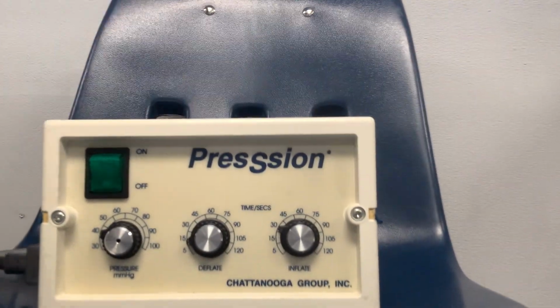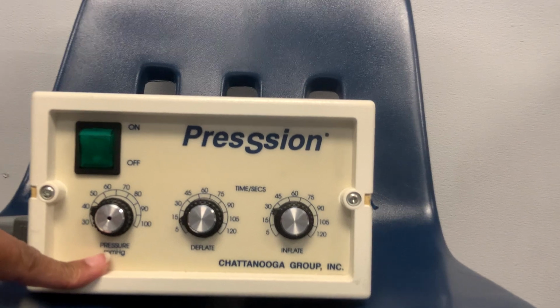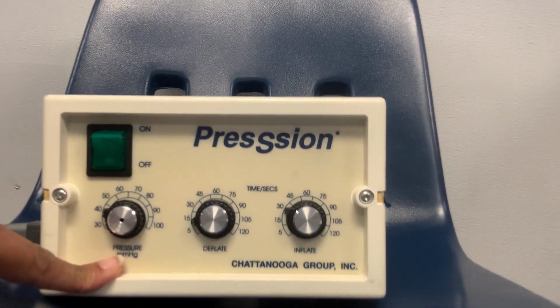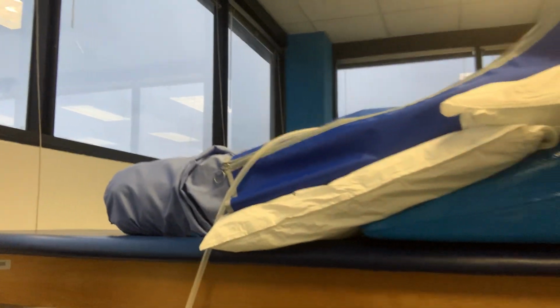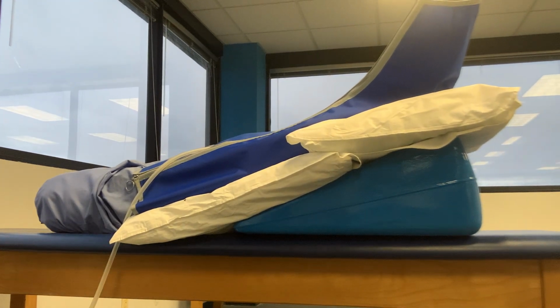The other two machines, the only thing you'd be setting is the inflation pressure, and you would actually have to wait to turn your machine on to be able to set that. Okay. So once your machine is set, then I can get ready to assess if my patient can tolerate that level. So I'll go ahead now that my machine is set and turn my machine on.